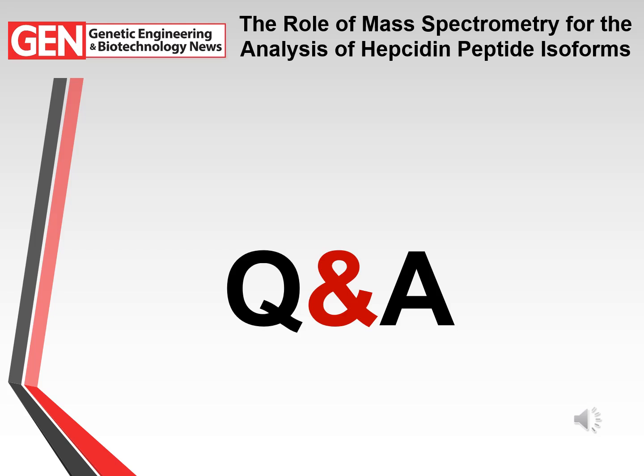But LCMS certainly allows us to get to very low levels, and more and more groups are going down this path. There are standards available for all of the different Hepcidin isoforms, even Hepcidin 24, the one that's relatively recent in terms of being established as an endogenous form, and a combination of high-resolution mass spectrometry and triple-quad mass spectrometry with electrospray front ends work very effectively.